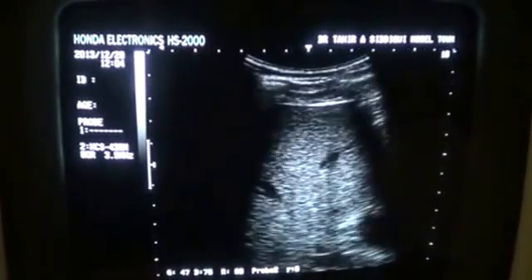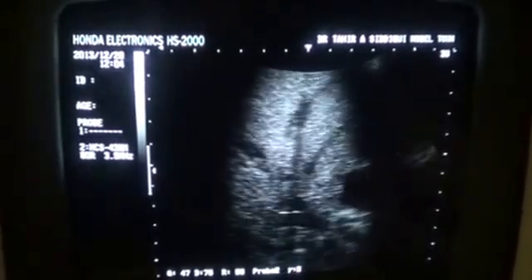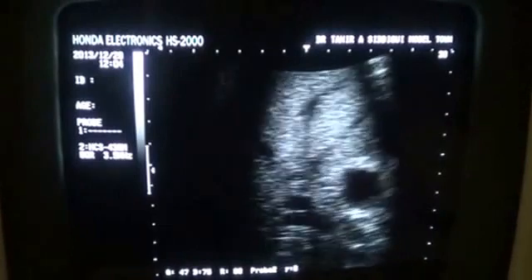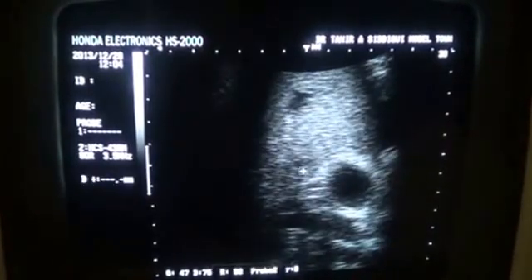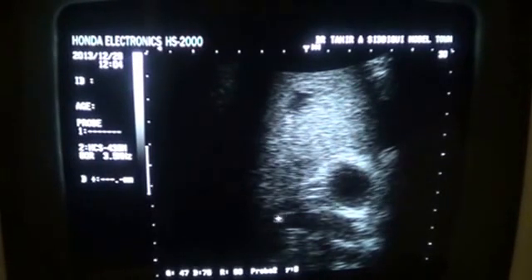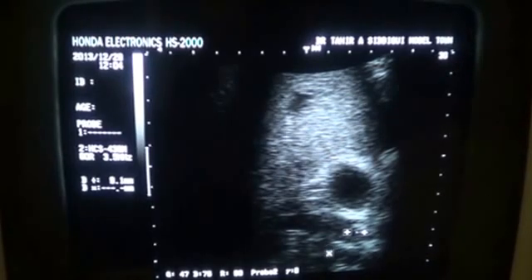Let me magnify a bit to show you the cause. This is the mid-CBD, this is the gallbladder, and this is the calculus in this area. The CBD measures 9.1mm and this is the portal vein.